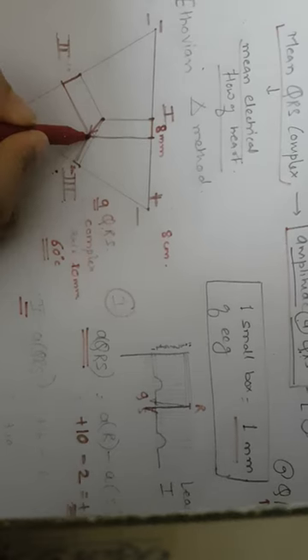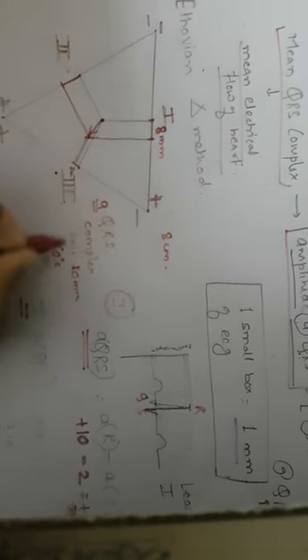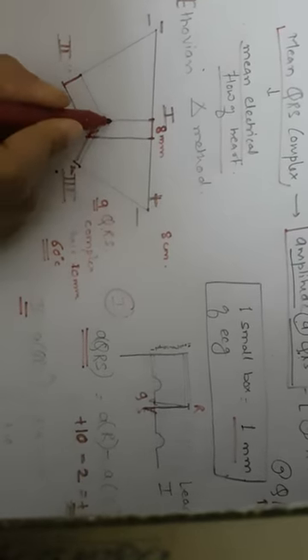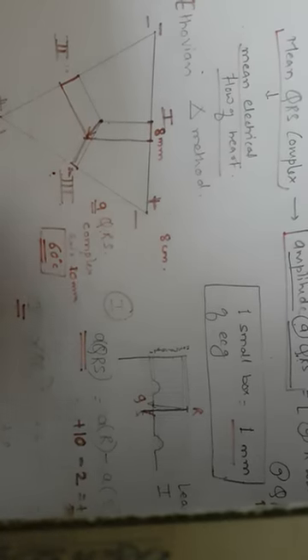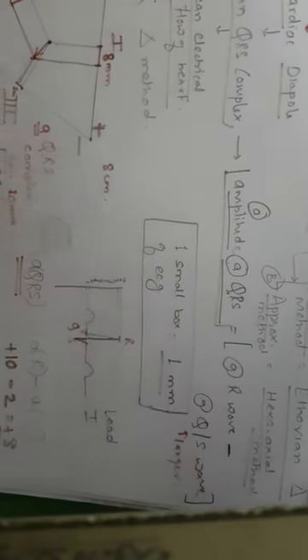Then you draw the perpendicular from those points, and you find out the joining point. Then you draw an arrow from the center of the triangle to that joining point. Then you can find out the amplitude of cardiac dipole by measuring the length of the arrow, and you can find out the angle by measuring the angle like this. So you will get an accurate value of cardiac axis. Okay, so this is the method by Einthoven triangle. Now we'll see the approximate method called the hexaxial method. There is one more method, that is the quadrant method.